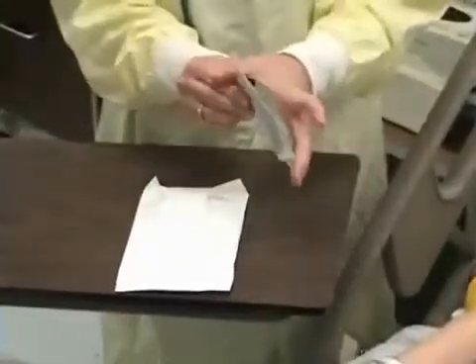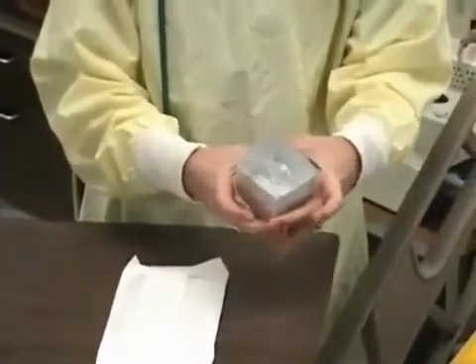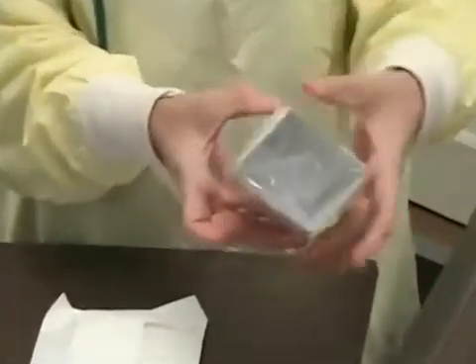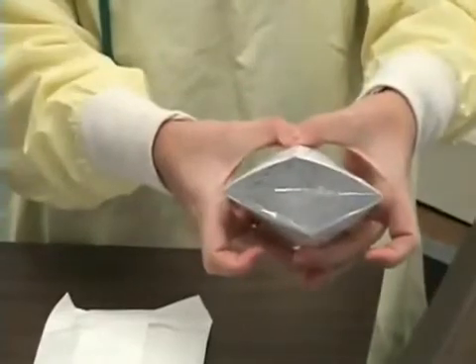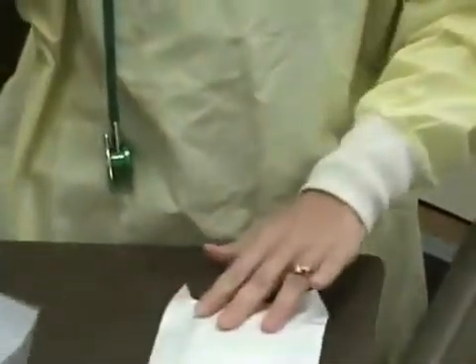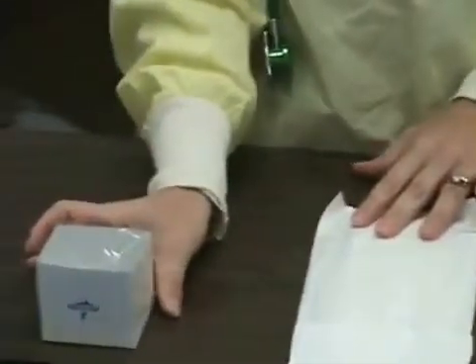First, I'm going to remove my cup from my normal saline. You can open it by touching the outside. There's a plastic liner in it. I'm going to set it to the side. And I will open my normal saline and pour it in.